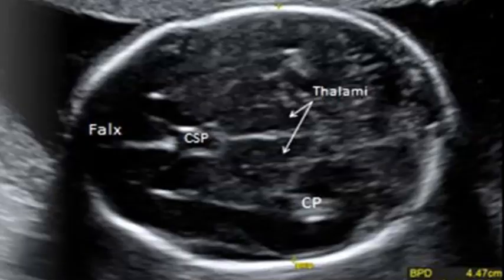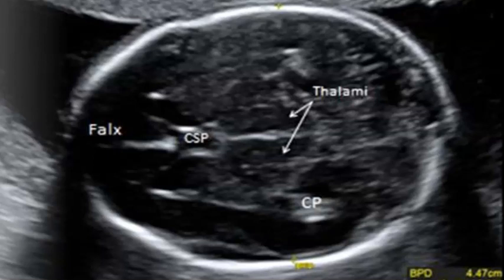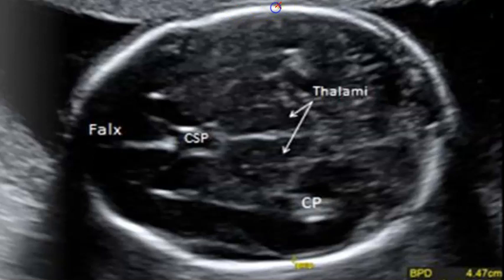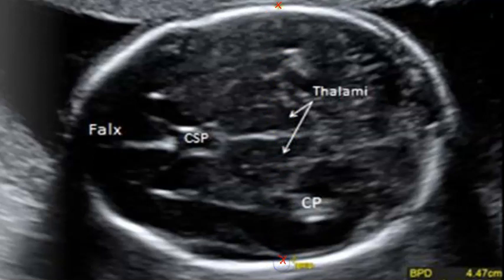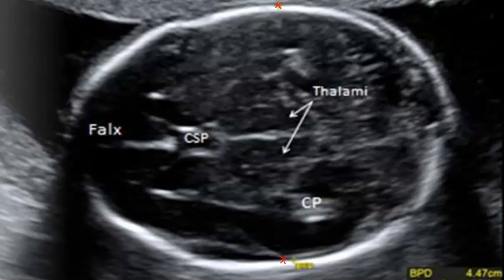Once we have all our landmarks and we ensure that we're at the correct level, let's see the proper way to measure. We're going to place our calipers leading edge to leading edge — right at the first edge of the parietal bone on the outer edge of the skull we place our first caliper, then go straight across and put our second caliper at the inside edge of the skull. You should measure at the widest part of the baby's head, which is usually about where the baby's ears are.